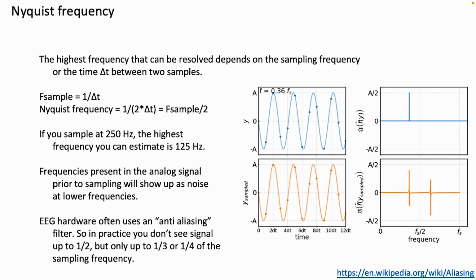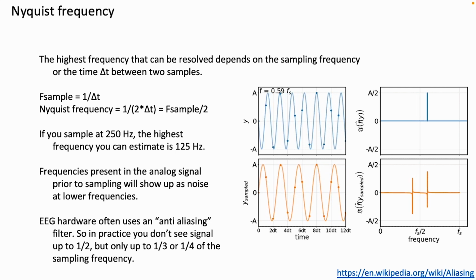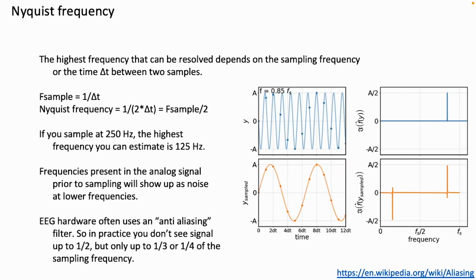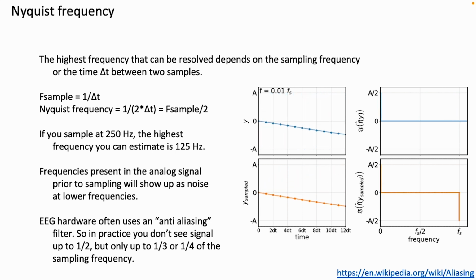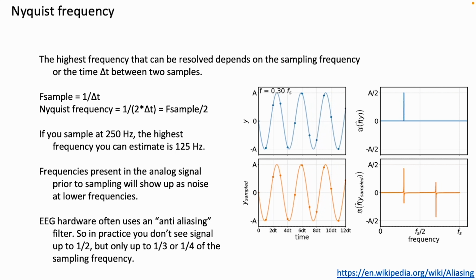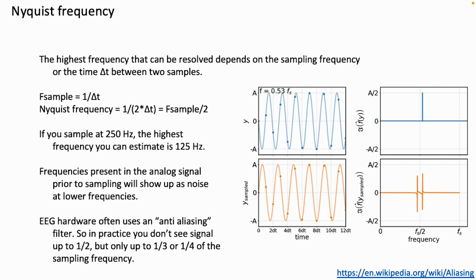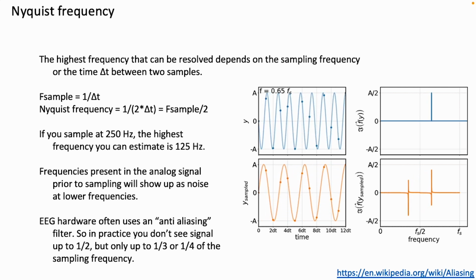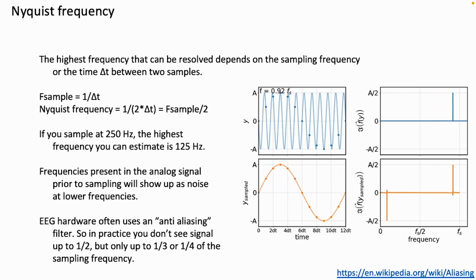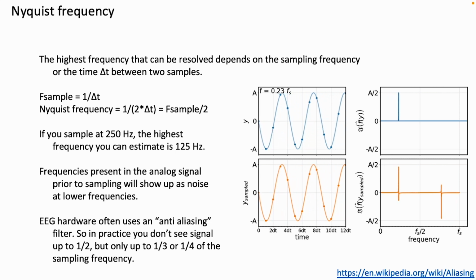I must say that at the Donders, by default we sample at 500 Hz. So our amplifiers allow sampling at various sampling rates, but by default we sample at 500 Hz, since that gives us information about the EEG spectrum to about 125 Hz, like 1/4 of the sampling frequency. Sometimes we're interested in gamma band activity, which can be up to 80 Hz or possibly even up to 100 Hz. So we're able to capture all the EEG activity if we sample at 500 Hz. Whereas if we would sample at 250 Hz, we would not be able to study the gamma band activity. But if you're interested in lower frequencies, then sampling at 250 Hz would be fine.